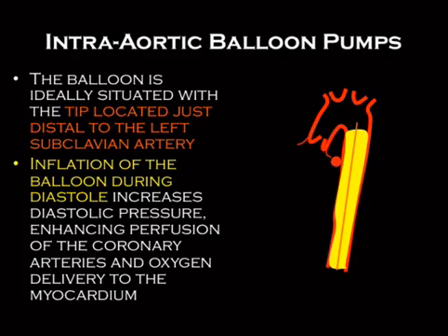So it's down, and it's inflating as the heart beats during diastole. So it's not inflated the entire time, it's periodically inflating, and the purpose is to help drive blood back in through the coronaries. The thing you need to remember, though, as a radiologist, is where it's positioned, and it should be positioned distal to the takeoff of the left subclavian artery.